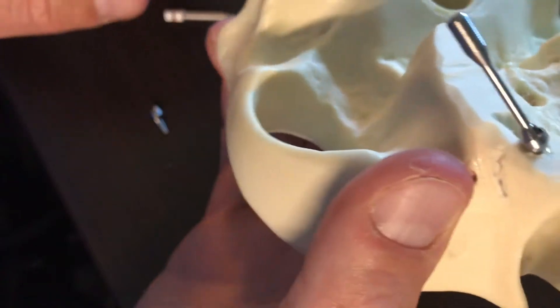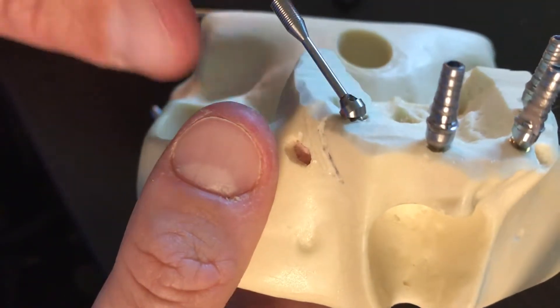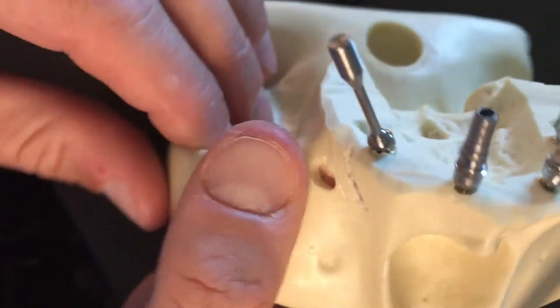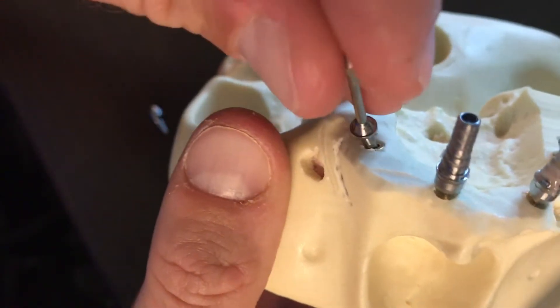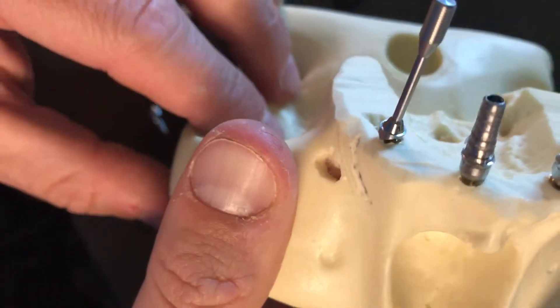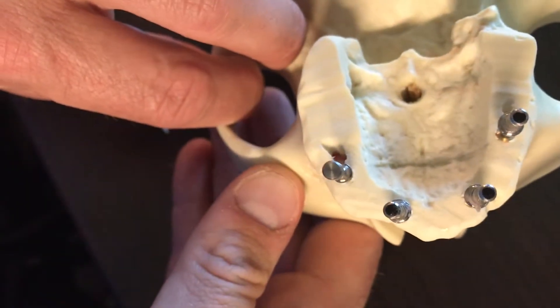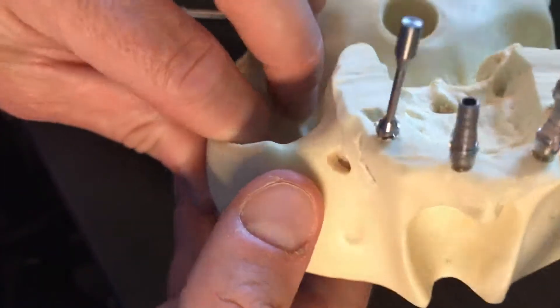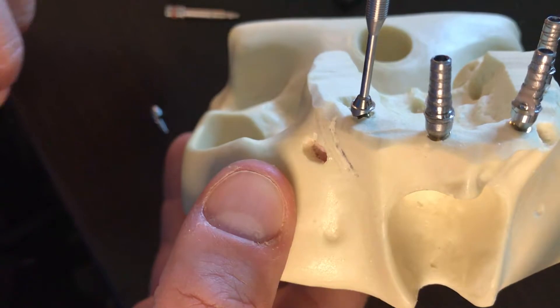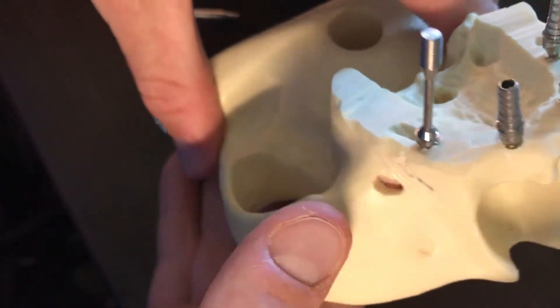This position on the distal aspect is not going to work — that's nowhere near parallel. If I lift it up and bring it around to the next position, we're still not there. Pointing one of those dots to the buccal absolutely helps — that is darn near getting this thing close to parallel for an easier path of draw on our prosthesis. That's for the hexed abutment.